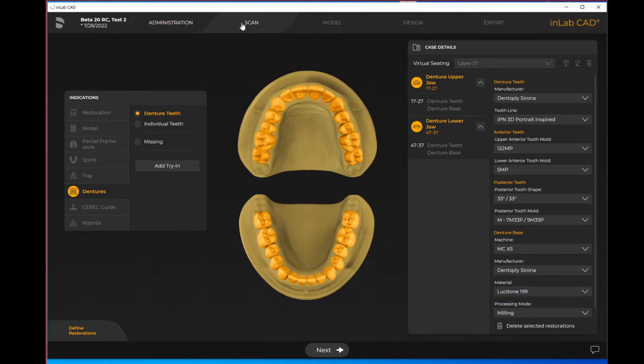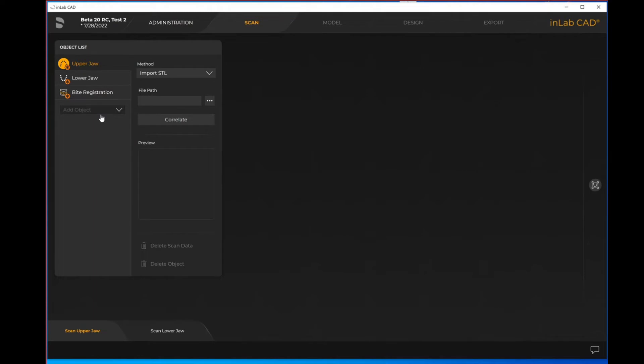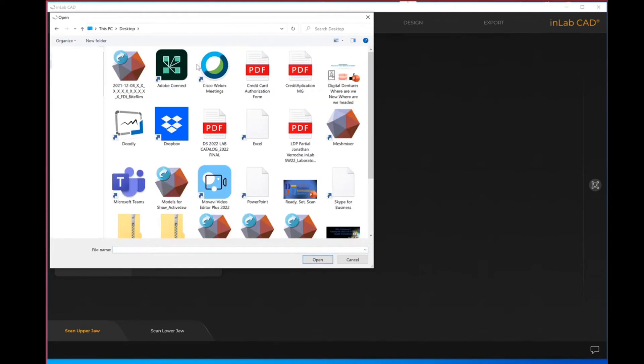We can see here it is scan. At this point in time if you were connected to something like an inEos X5 it's going to automatically think you are physically scanning. However, this is also the step where we are able to import our STLs. Under method, I am not connected to a scanner currently, so that's why the scan step is grayed out and the method automatically defaults to import STL. Now you can see here I've got my object list for the type of restoration or prosthesis I'm designing. Where it says file path you'll see these three dots. I'm able to find my files that I want to import.